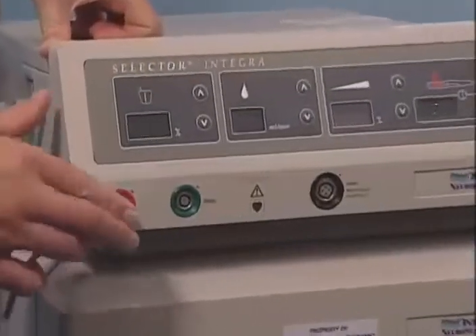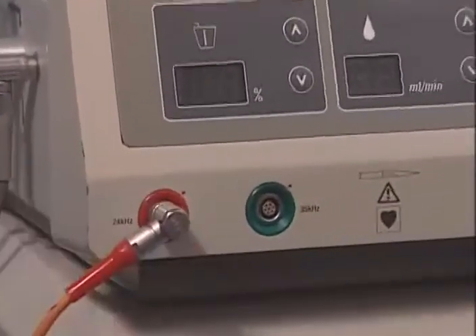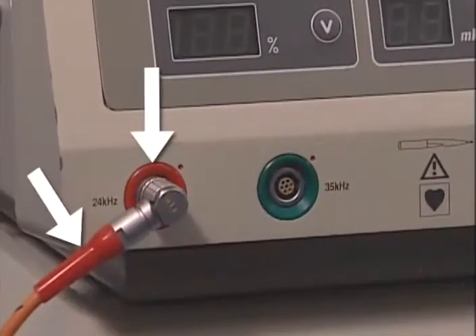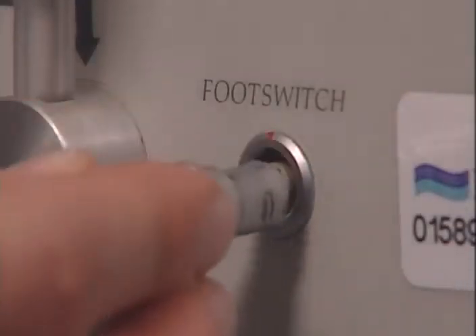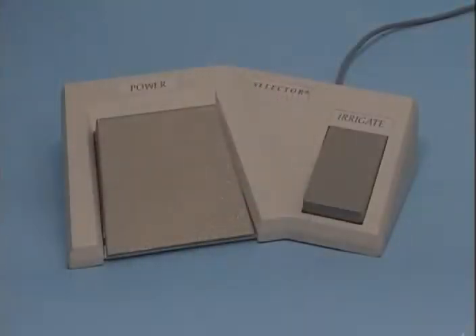Connect the handpiece plug to the color-coded port on the front of the console. Plug the foot switch into the foot switch socket located on the left side panel of the console. Place the foot switch in a convenient position for the surgeon.